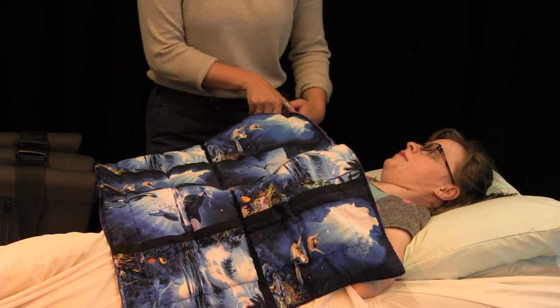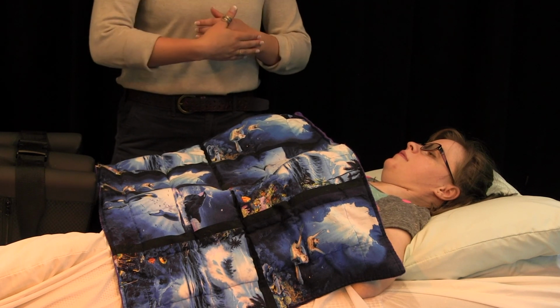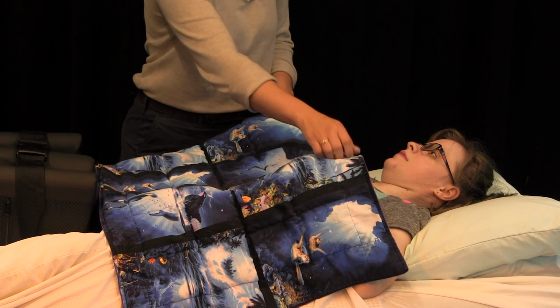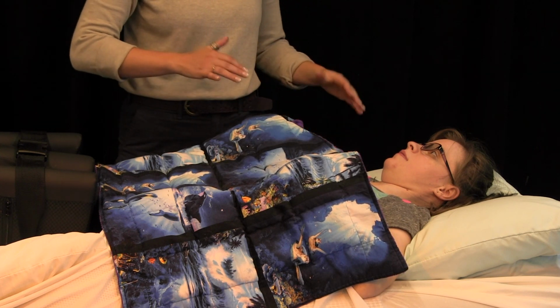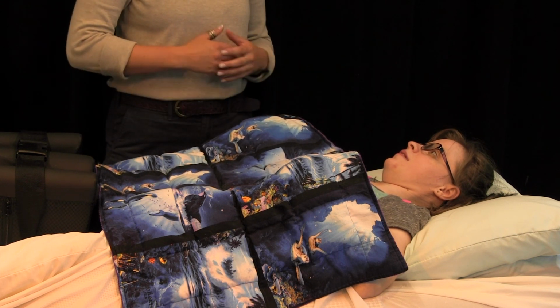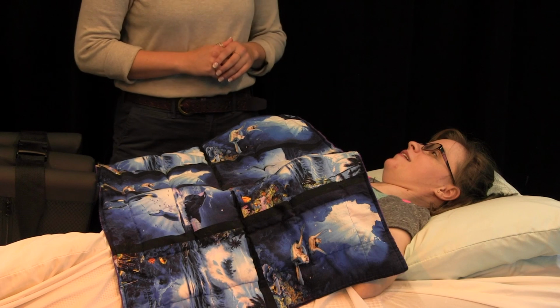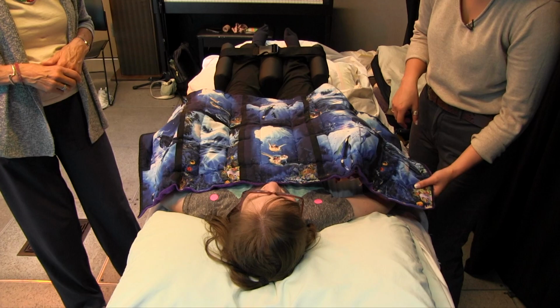And this is a 4-pound weighted blanket, so it is helping keep her arms in this position without stretching her shoulders too much. Do your shoulders feel tight, or are they comfortable right here? No, they're comfortable. Okay, good. And how are the rest of your arms feeling? Much better. Okay, that's great. Once all of the supports are in place, be sure to check in and make sure that the body is still in alignment after making adjustments throughout, and continue to check in with the user's comfort.